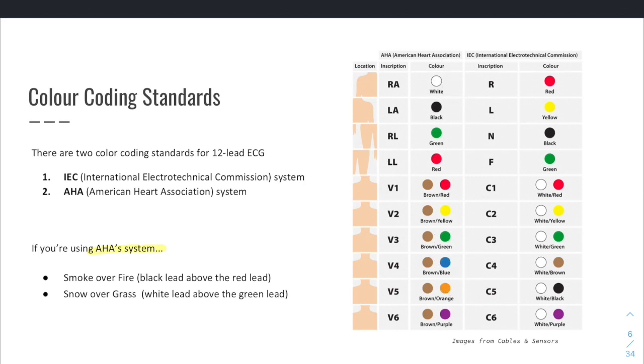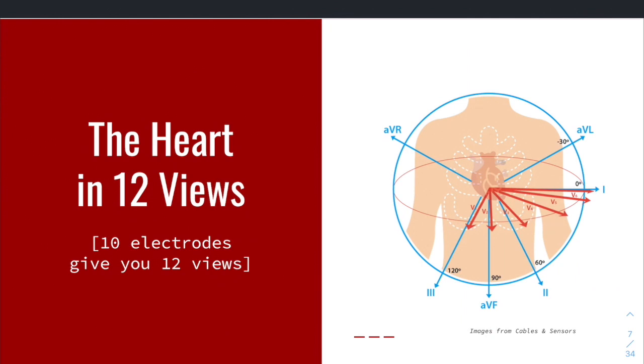So you have the appropriate position, the appropriate conditions, and you're associating the correct leads with the correct colors, and you're applying them accordingly. That is also important to keep in mind. Okay, so let's talk about the views of the heart.